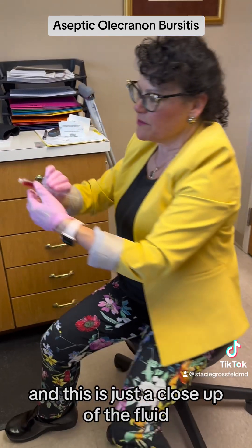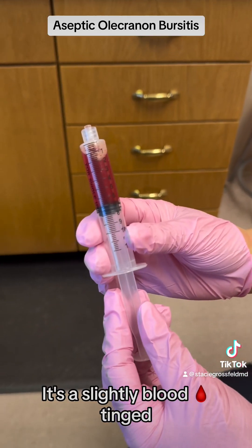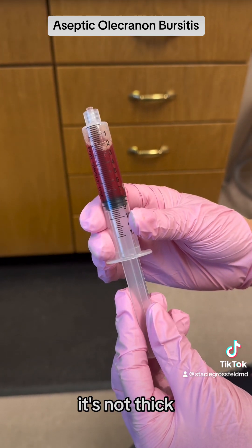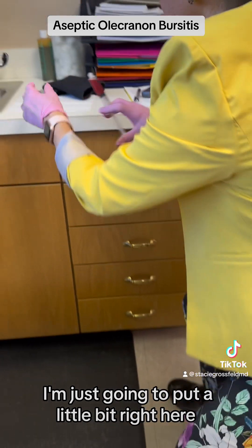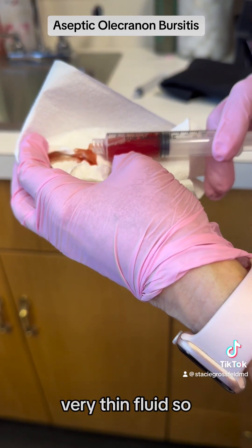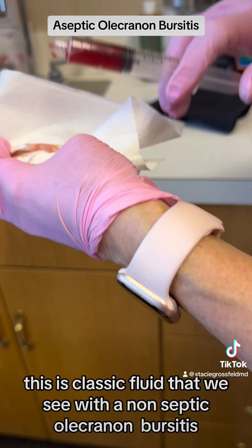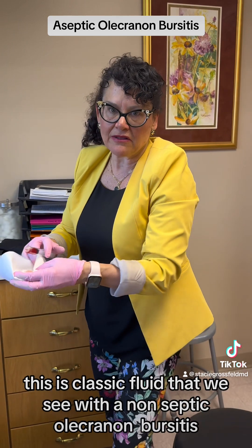This is a close-up of the fluid — this is pretty classic. It's slightly blood-tinged, it's not thick, it's rather thin. This is classic fluid that we see with a non-septic olecranon bursitis.